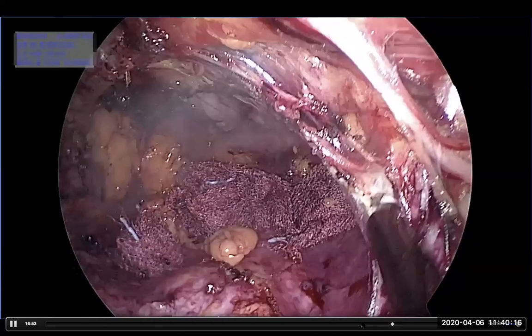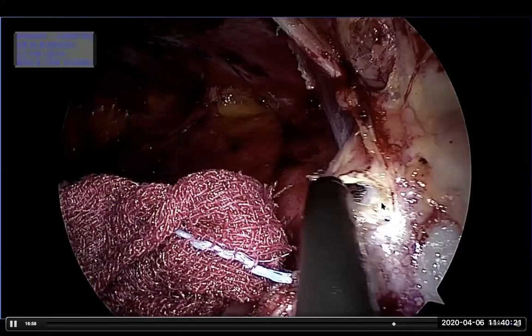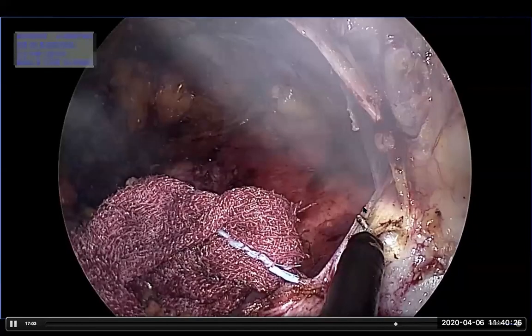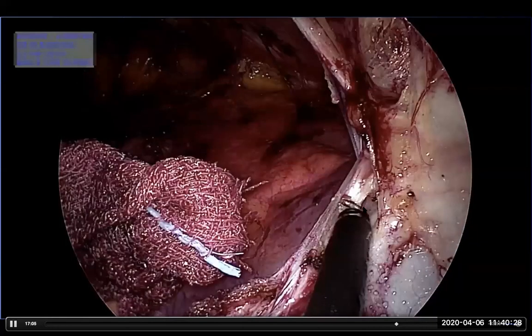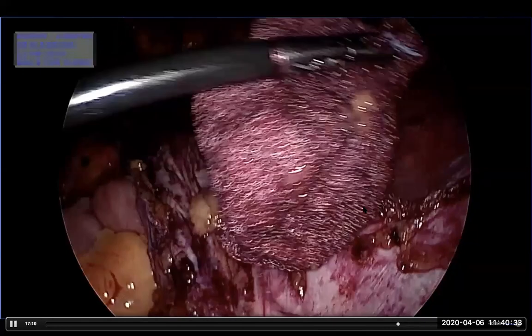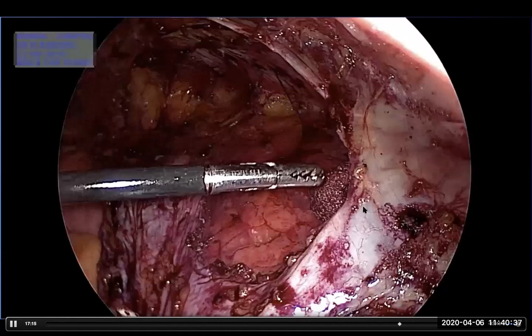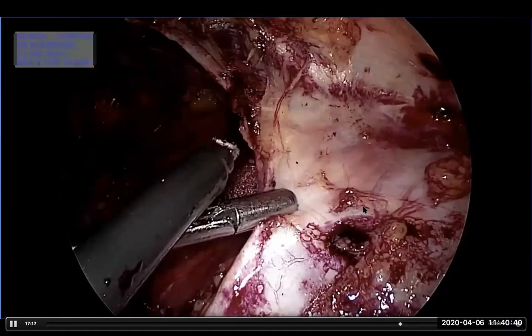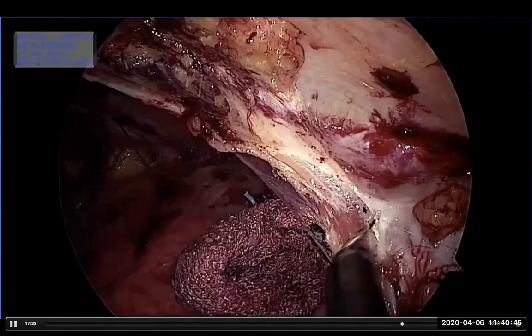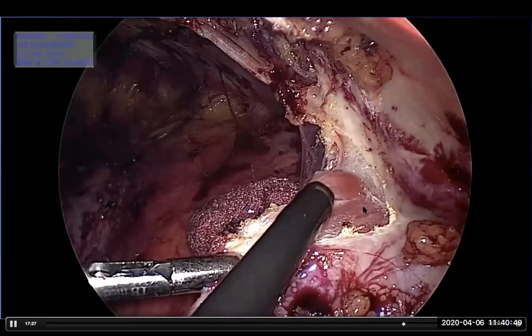Now you see that peritoneum is coming from underneath. This is the peritoneum here, and it is coming right under where you're dividing it. So unless you sweep it before you divide the transversus, you're going to end up opening the peritoneum. And when a small bit of the peritoneum opens up, then it very quickly expands and becomes a big tear. So even the technique of sweeping the peritoneum down can actually go wrong. Now you see the fleshy fibers of the transversus has started coming.